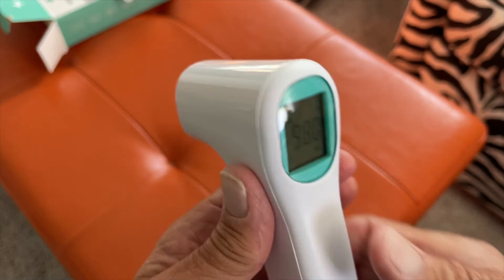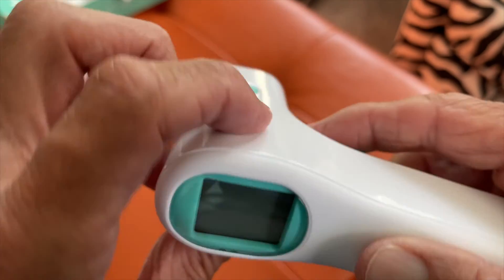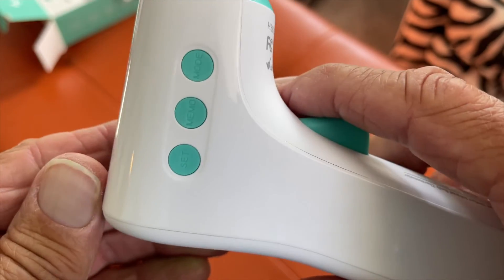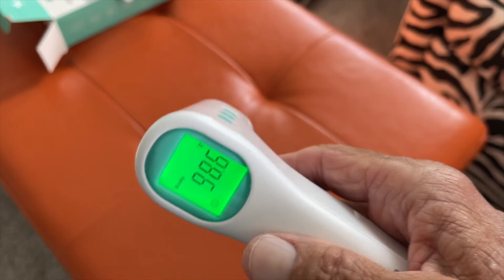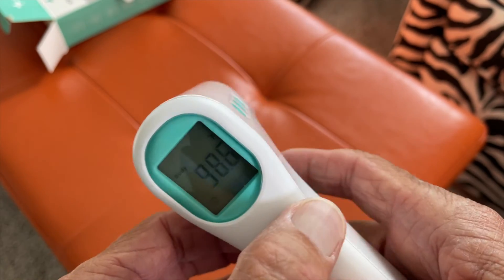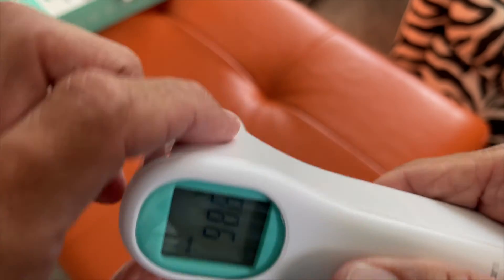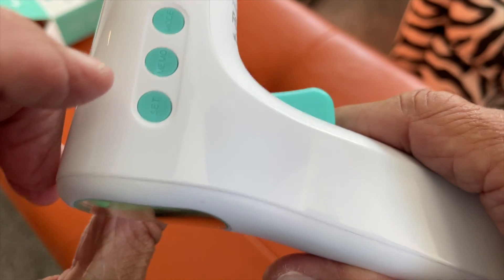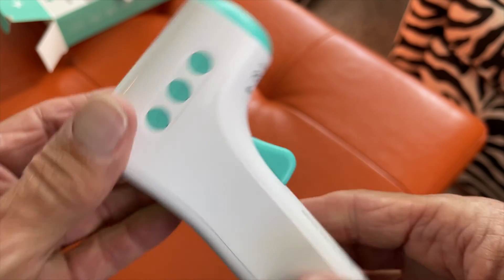To turn it on or off, you just hit this set button on the side. Watch — off, it's off. It will stay on the display for a while, then go blank. To turn it on, you do the same thing — press that button right there and it's on, ready to go.